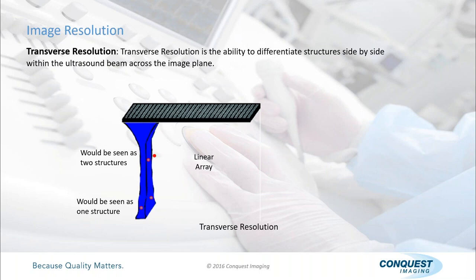If you were to pass this around, and I highly recommend you do it, but it's hard to see through the top of this one. This is kind of old, but I use it to travel with. There's this object right here. The top one is very dense, but it's a cylinder, goes all the way through the Phantom. So it's one object that goes from front to back, right? And so when we scan with our probe, say it's a linear probe, what we'll see on our monitor is a cross section or the circle, like it's displayed on the Phantom, correct?